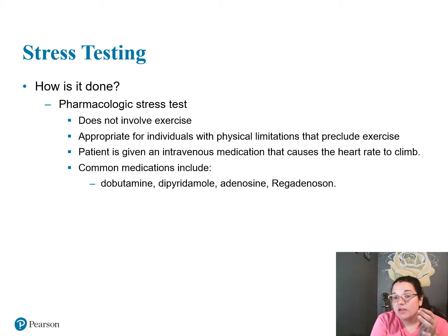Another form of stress test that you can do is called a pharmacologic stress test. It's exactly what it sounds like. Does it involve exercise? Nope. What does it involve? If you had me in EKG 1, you know it involves drugs, medication. So it's appropriate for individuals that have a physical limitation that precludes exercise.